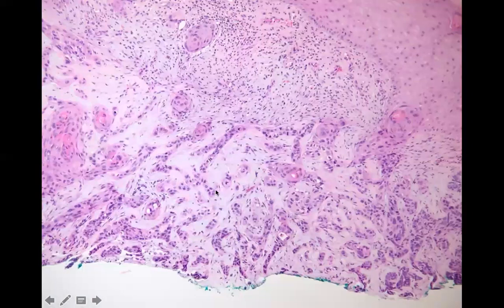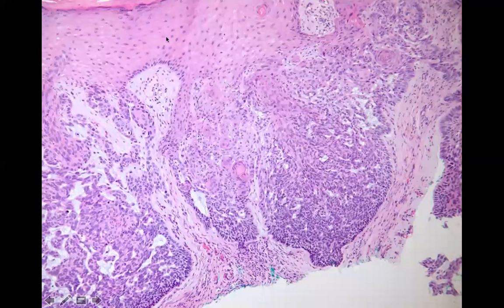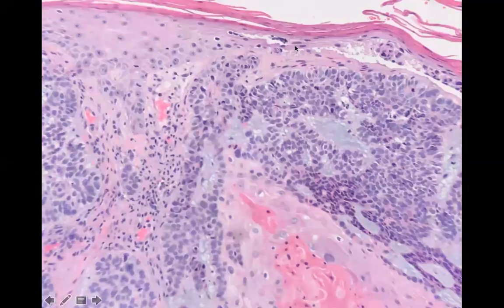Here's an up close of what looks like squamous cell carcinoma. This has mistakenly been called basosquamous carcinoma. These are not basosquamous carcinomas. Basosquamous carcinoma is when the lesion looks like a squame and a basal at the bottom of the lesion, not at the top where it's irritated, because you'll see this irritation change. See, here it's a little irritated and you're getting a little squamatization on top. You see this in almost any basal cell because they're often ulcerated, okay?